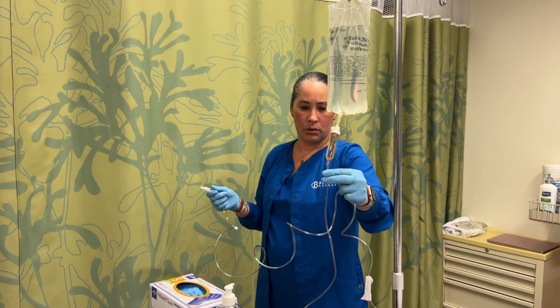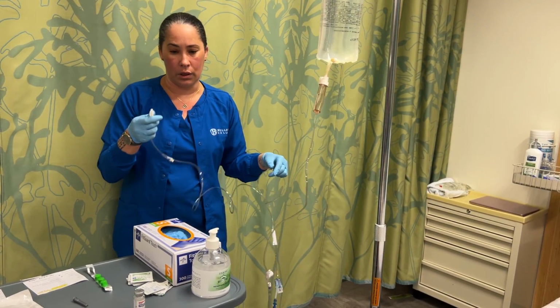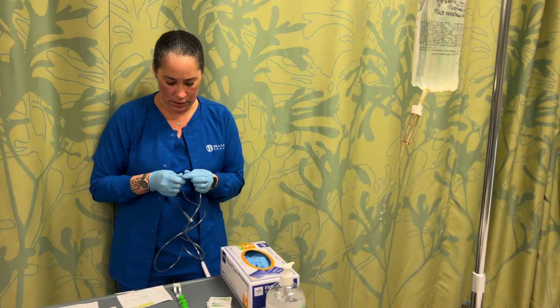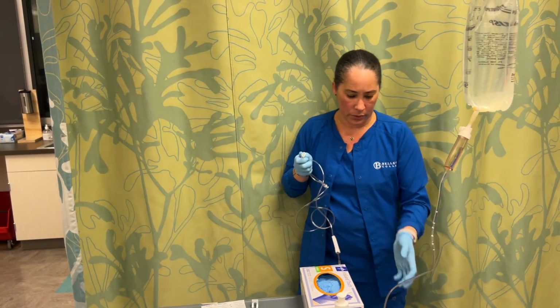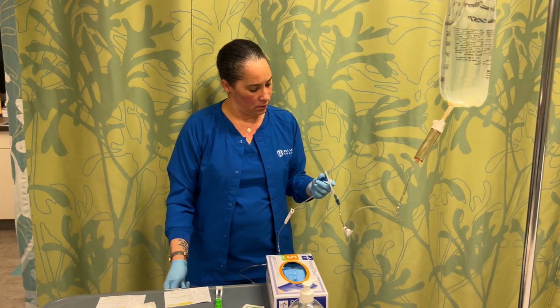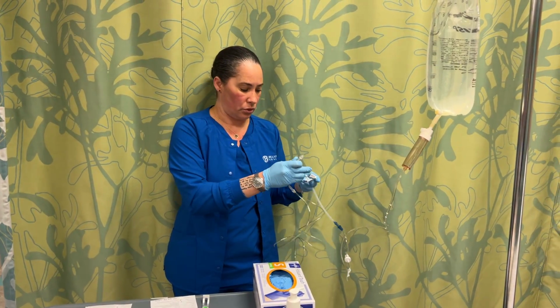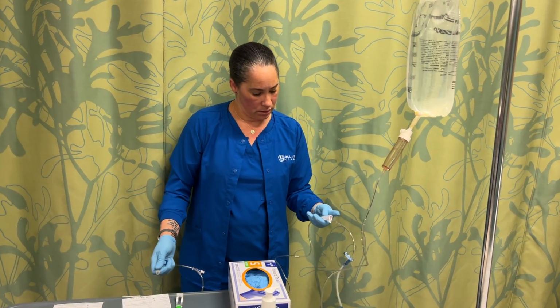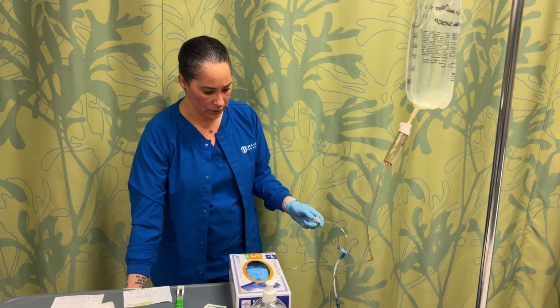Basically, you just want to make sure that there are no air bubbles, because, just the same as with the med, you don't want any bubbles in the line. So we're going to take the cap off, and we are going to release our clamps. We already put a green cap on it, so it's sterile, but if we didn't, we would. You can just do this over the trash. Just make sure you don't touch anything. And you're going to release this clamp and just let it run through, and you can see the bubbles go.